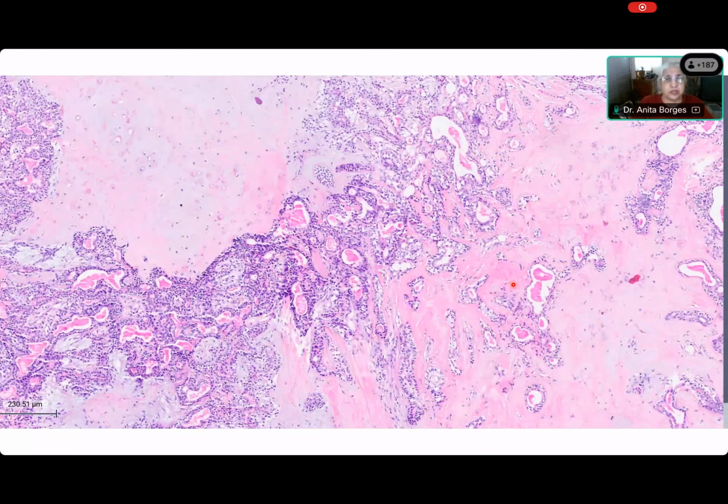Okay, now what do you see here? Yeah, Shivani. What do you see here? Ma'am, there is a mixochondroid stroma. Excellent. And the lymphocytes. Now, come on.